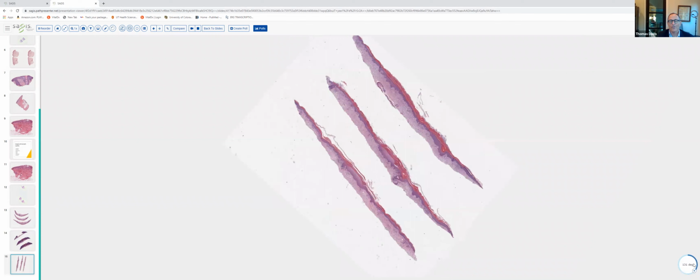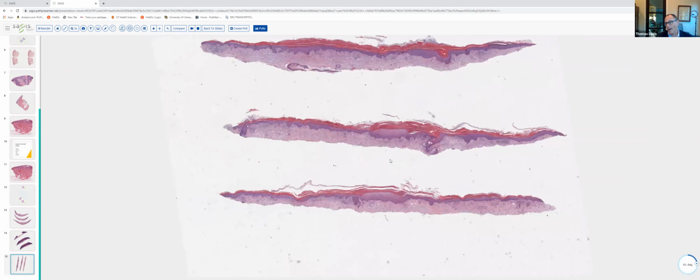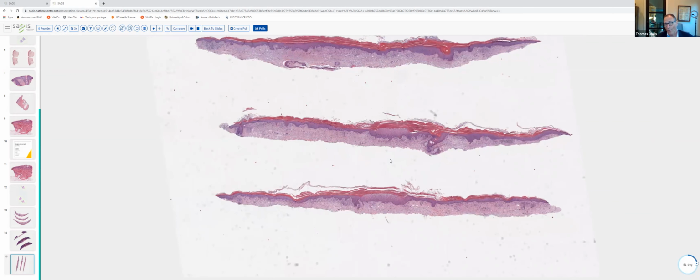The correct diagnosis in this case is PRP. PRP is a really tough diagnosis to make. And I found that oftentimes it's only when I see the second or third biopsy, unless the changes are 4+ like they are here, that I really think about the diagnosis of pityriasis rubra pilaris. So we got a trisected shave biopsy here from sun-damaged skin.